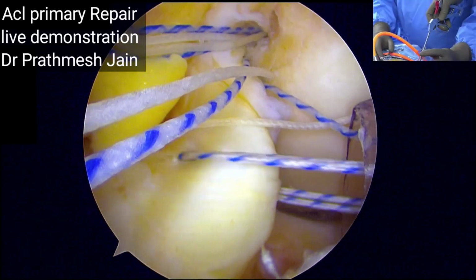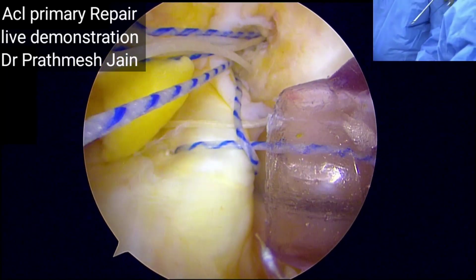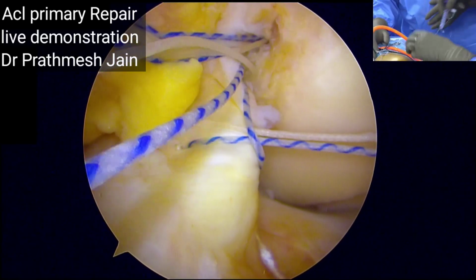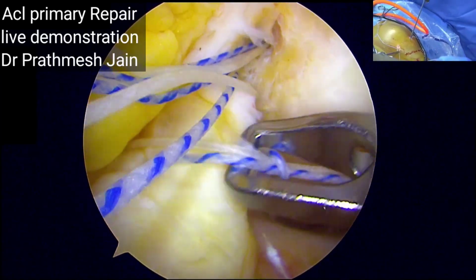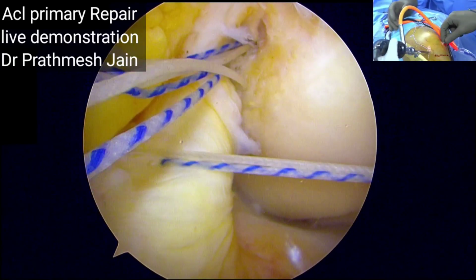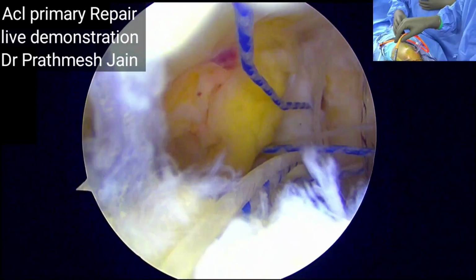The important thing you must realize is, because this is a sort of a crowded area, you might have problems with entanglement of the sutures. You should be good in suture management, and you should be able to clear out all the problems in the suture management.